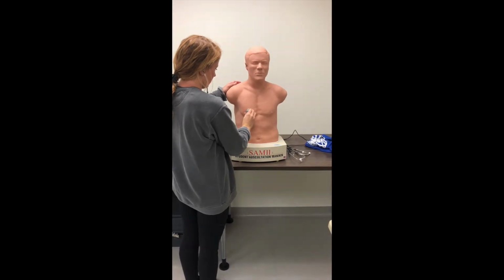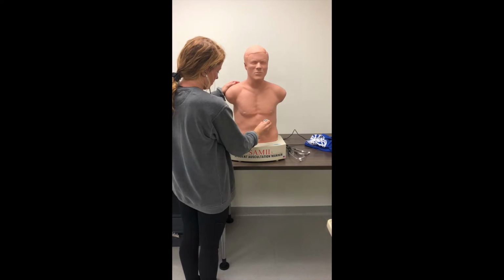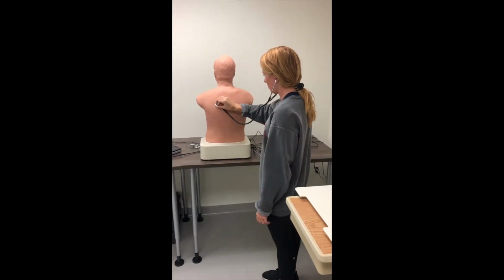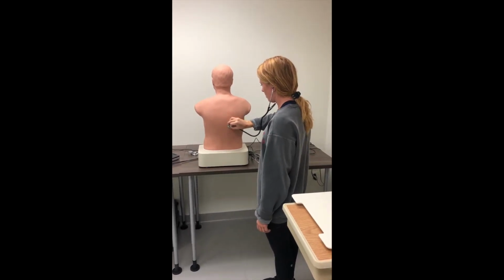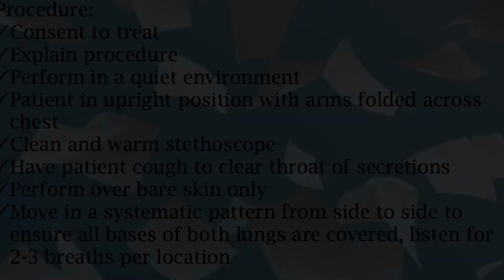Auscultation is performed in a quiet environment with a systematic approach, moving anteriorly to posteriorly. The patient is in proper positioning, ideally sitting or standing, and the stethoscope is placed on bare skin. The therapist performs this before treatment, and during and after treatment if deemed necessary.